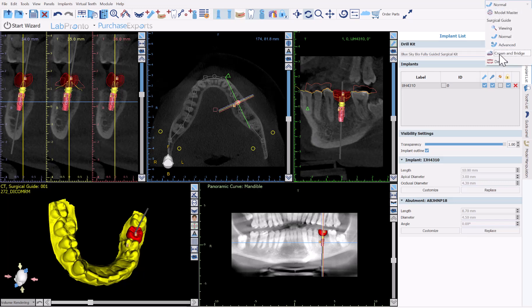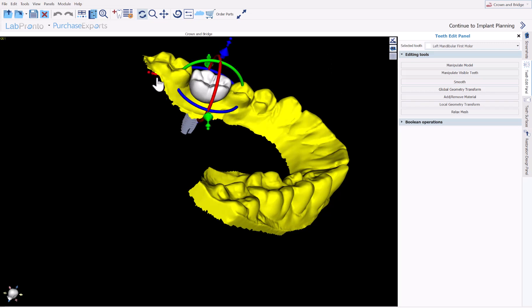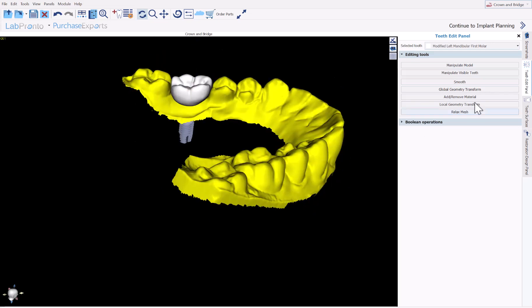Now I'm going to switch over from Normal to Crown and Bridge. If you want to resize the tooth or adjust contacts, you could just grab the nodes to resize — you can see the size changing. If you want to do any more editing work, you can use any of the editing tools to modify the tooth design. If you're happy with the design — and the functionality is going to be getting better over time — simply go to the Restoration Design panel.